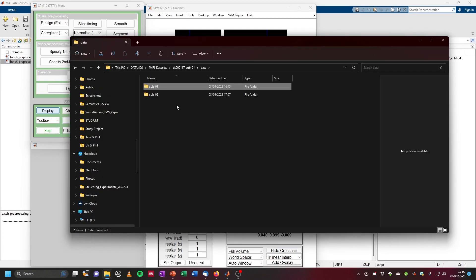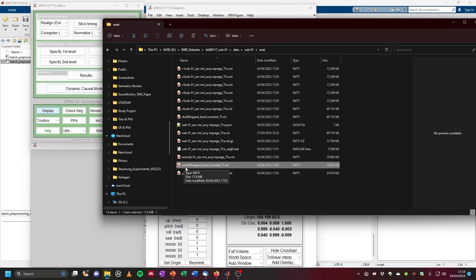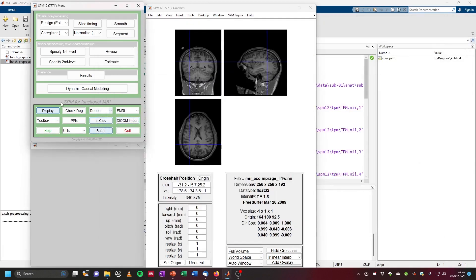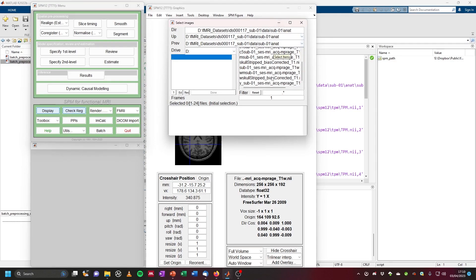When structural preprocessing is done for one subject, always perform a quality check. Navigate to subject 01's anat folder — it has created all the different output files. Most interesting are the W files, the warped or normalized images. We can check the registration of the normalized skull stripped and bias corrected image by copying the path and clicking check reg in SPM, navigating to the folder and selecting the W skull stripped bias corrected T1.